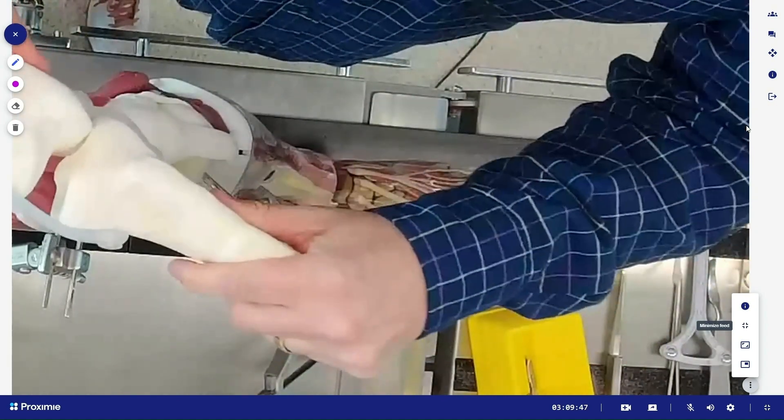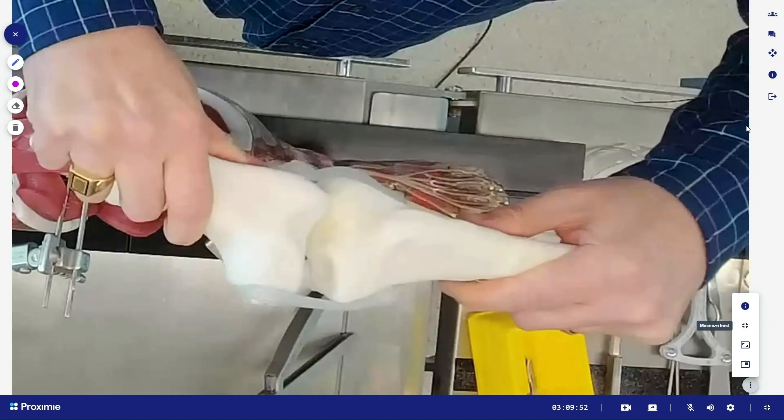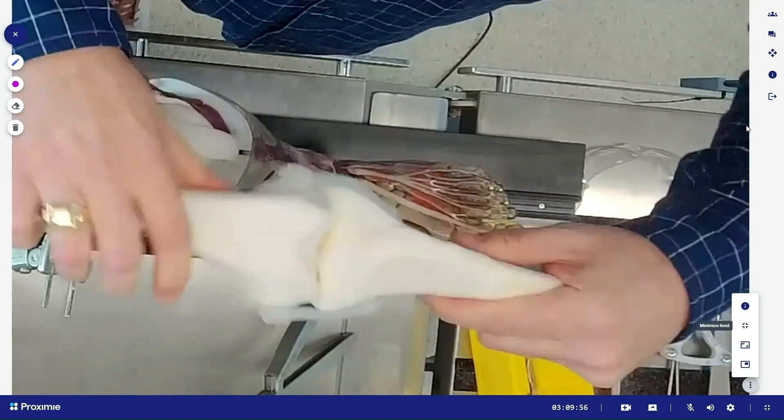The big failing with conventional models is that under that same pressure I was applying previously, you can see there's no real endpoint to those soft tissues. The gaps just blow out and the graph is no longer realistic.